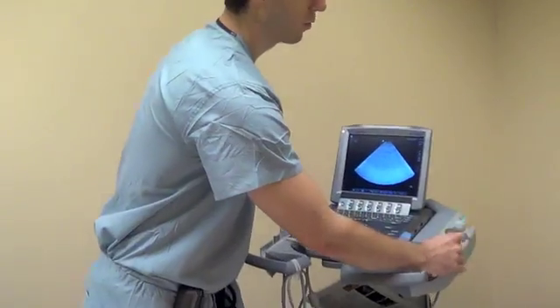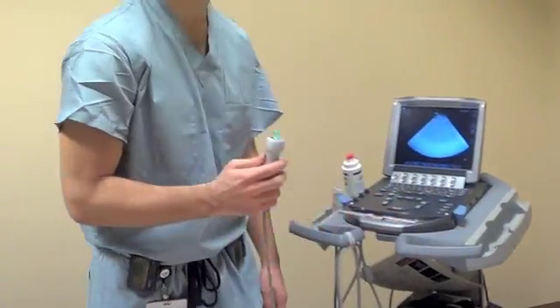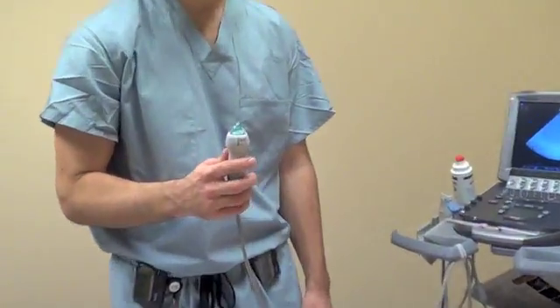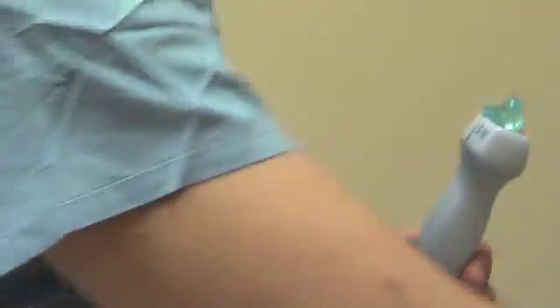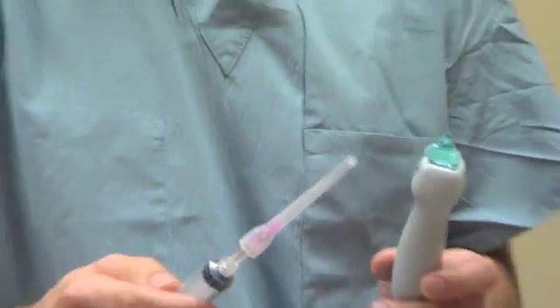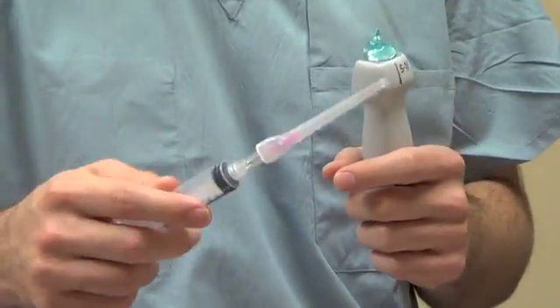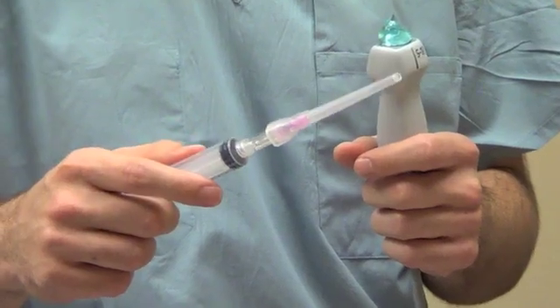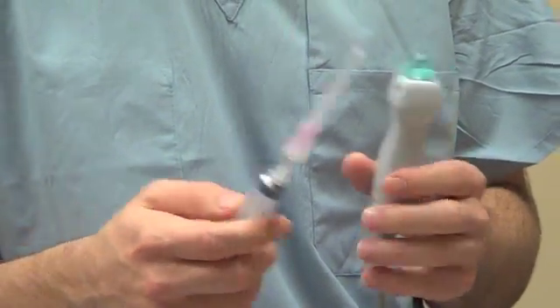To do this we use our ultrasound. We're going to talk about ultrasound-guided pericardiocentesis. We'll use our cardiac ultrasound and then we'll have a needle — in this case I'm going to show you one with an angiocath attached to it. You can often use the angiocath that comes with a central line kit for this.